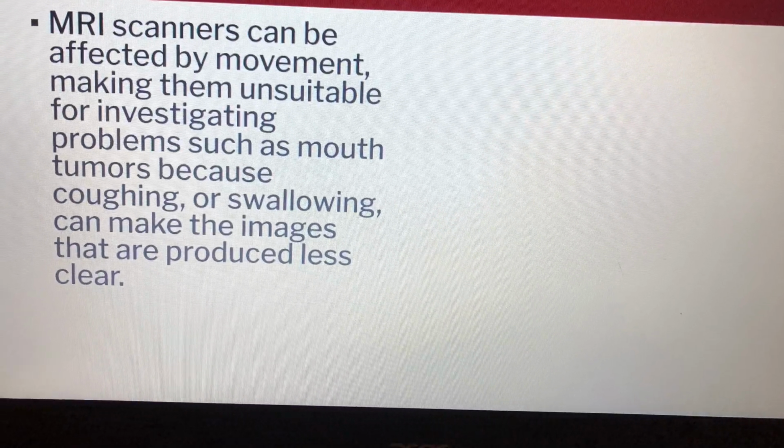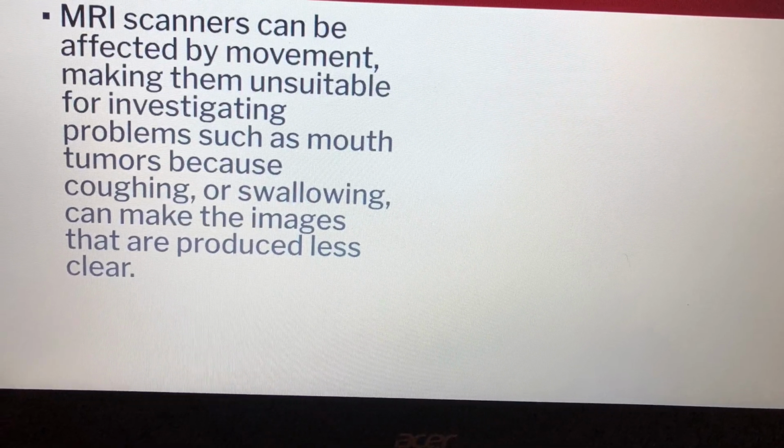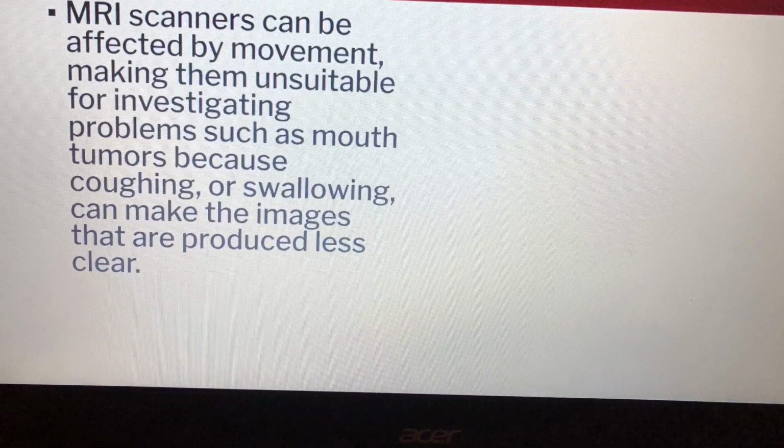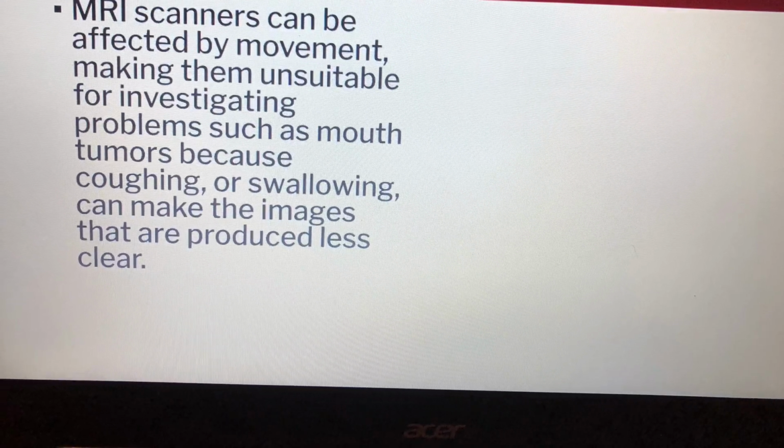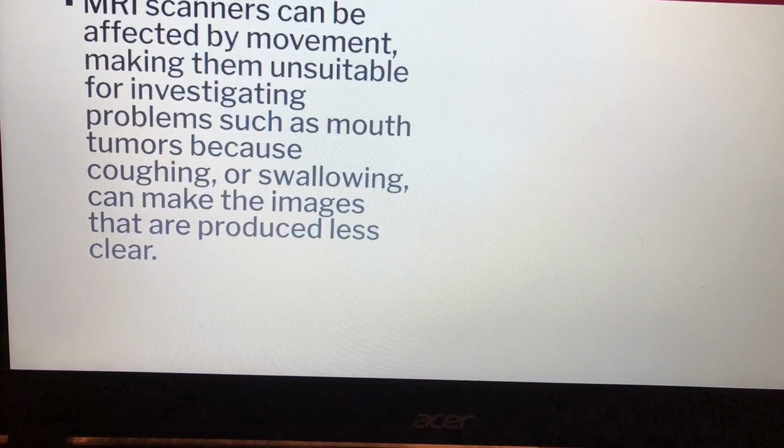Disadvantages, Part 2. MRIs can also be affected by movement, such as coughing, swallowing, or moving around, which can make the images less clear and not as reliable.